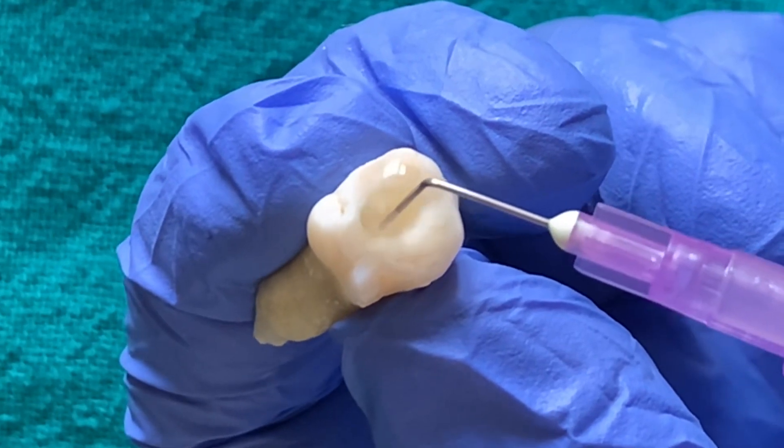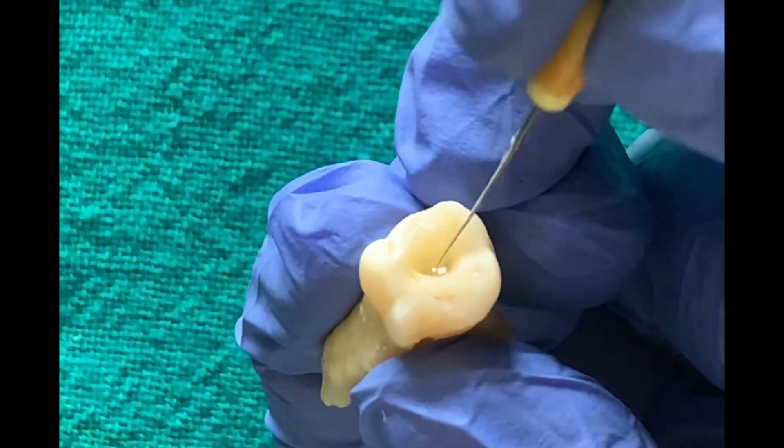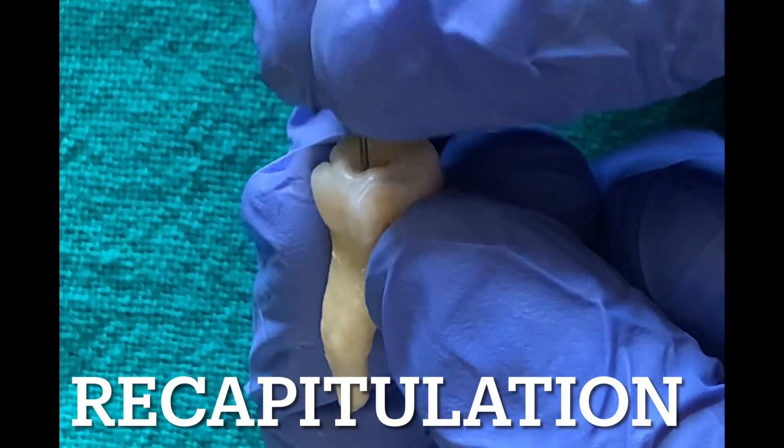On irrigation, you can see how much debris has come out, showing that active cutting has taken place. After that, we recapitulate the canal with a number 20 file.